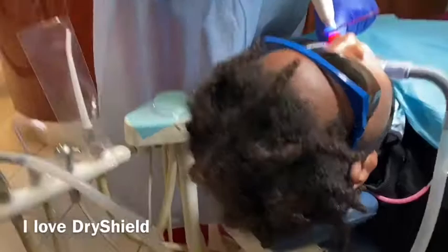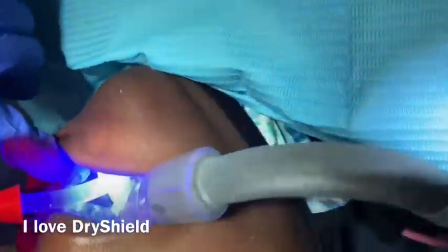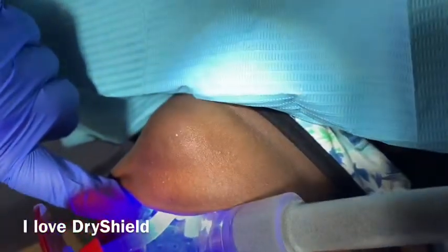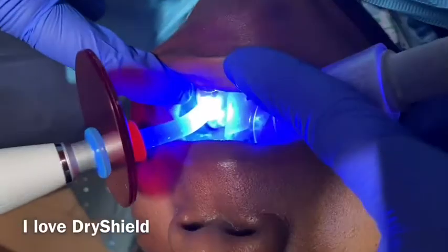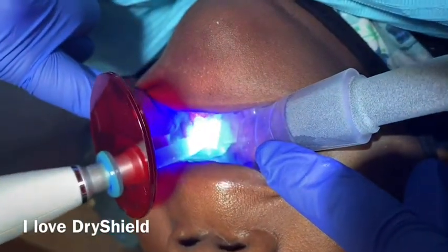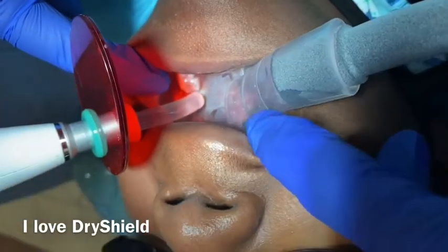I use this for sealing today and I just love it. I want to share with you guys that DryShield technology is amazing — great for sealing and sometimes even root canal if you are in an emergency situation. Really good.